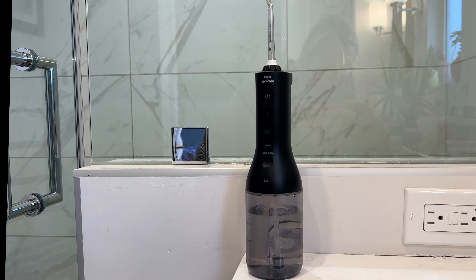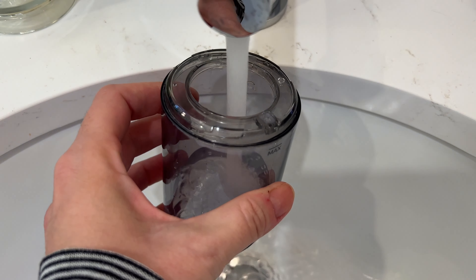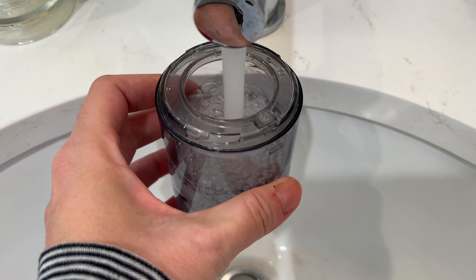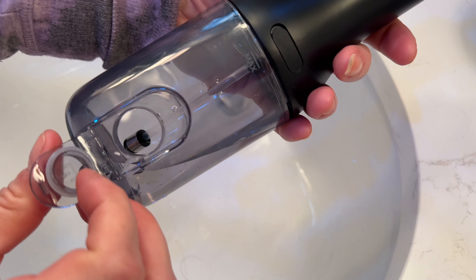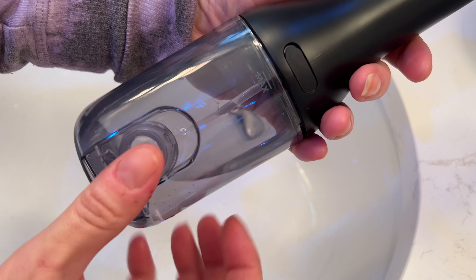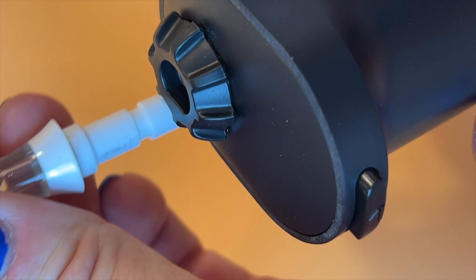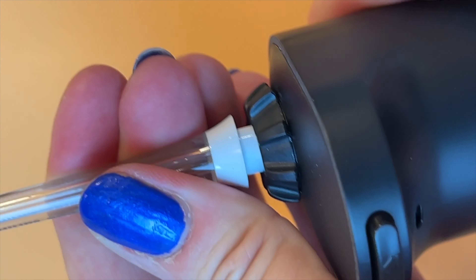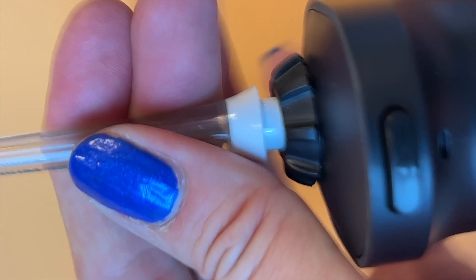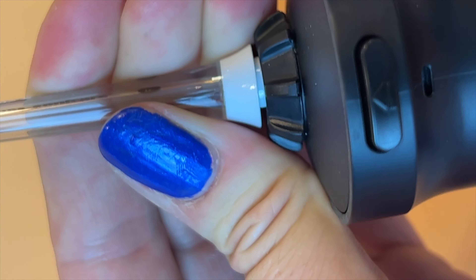To use the power flosser, make sure it's charged up. There's a small USB-C charging port in the handle. Fill the water reservoir with lukewarm water — it attaches to the handle with a simple twist, or you can use the little door in the back of the tank. Next, choose your nozzle and insert it into the top of the device. This isn't the most intuitive part; you need to loosen the collar at the top of the flosser to get your nozzle in properly. You're going for a distinct clicking sound. It took me a couple of tries, but once I understood what to do, it was easy from there on.